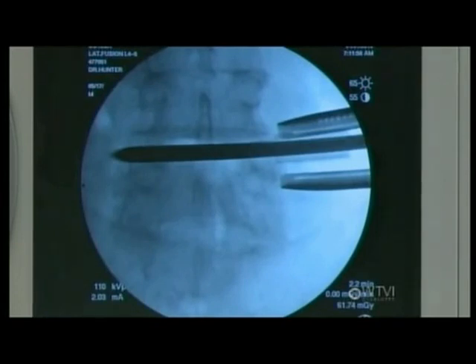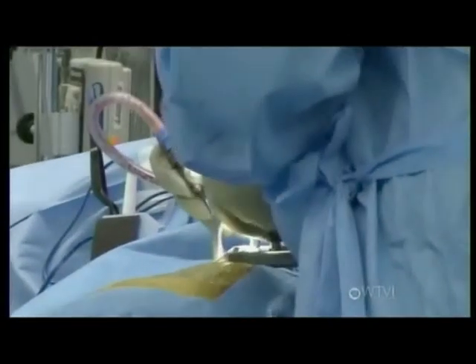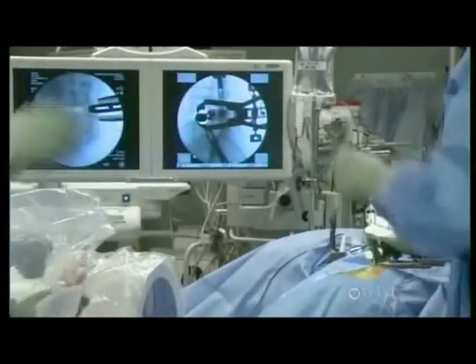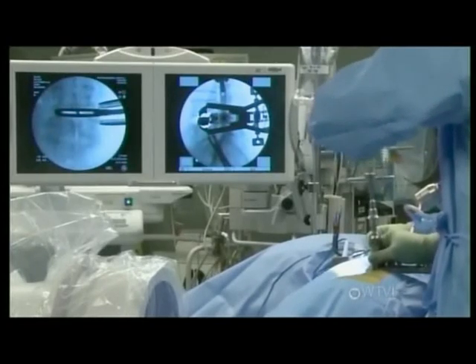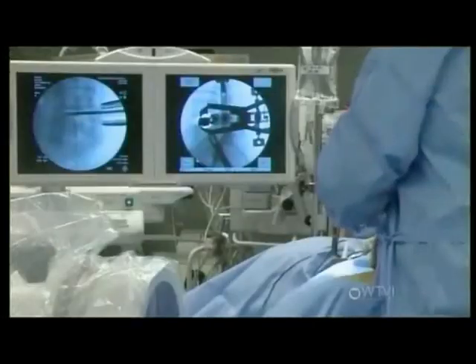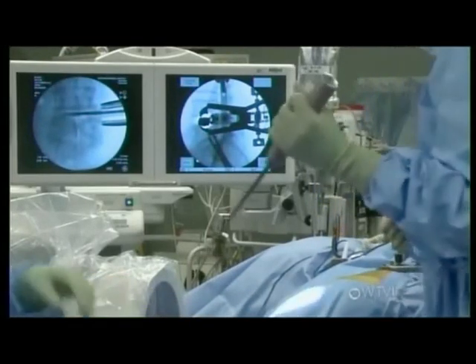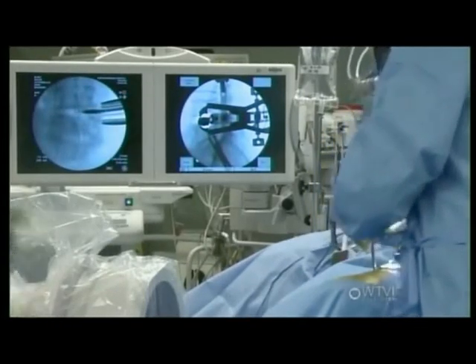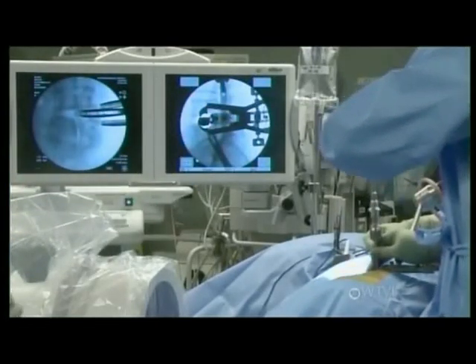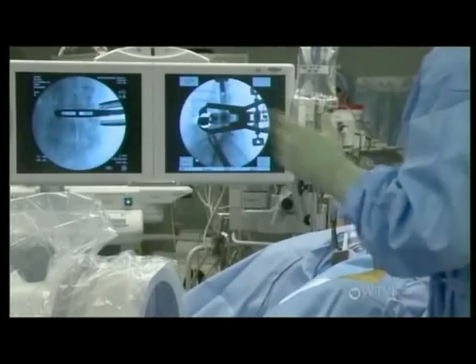We've already taken most of the disc out and we've gone to the other side, which is important. These trials now — we're trying to find what's the best match for this disc at this level. You might be able to see movement of the vertebral body as we push this in. See how it kind of jumps up a little bit — so it's going to orient itself well. We're just marching our way up from a small graft to a bigger graft, to a bigger graft. You can really see that movement on that vertebral body there. Give it a minute or two to kind of relax and expand a little bit.